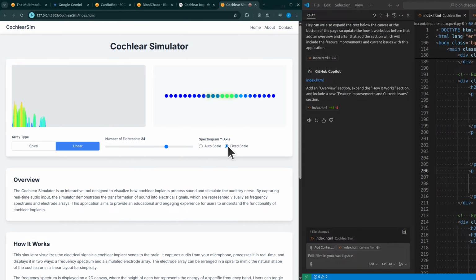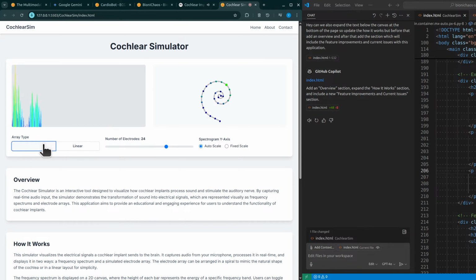Exactly. And it's rendered in 3D using Three.js, apparently. You can interact with it, spin it around, zoom in. So you can see how the electrodes fit within that complex shape. That adds another layer, doesn't it? It's not just signals, but signals in a specific place. Precisely. It highlights the mechanical challenge, too.